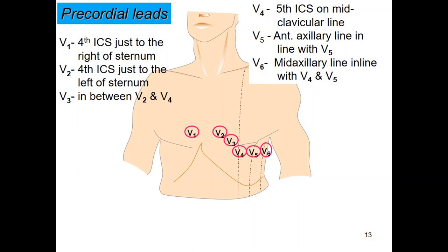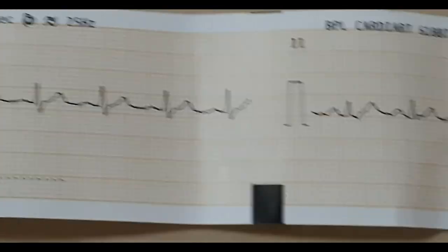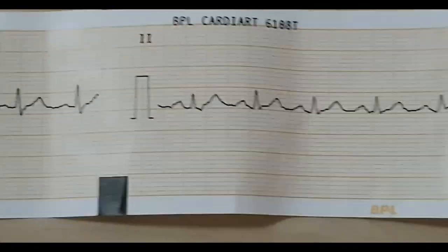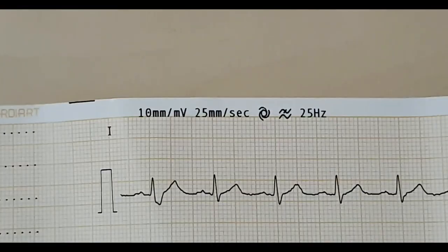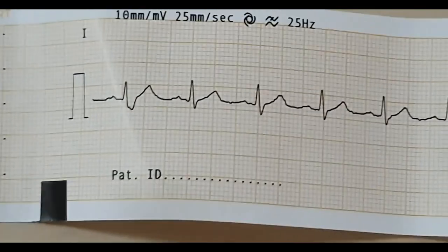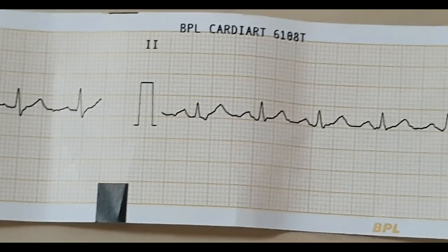So if you connect all these 12 leads properly, connect it to the ECG machine, turn on the machine automatically or manually, you get a strip of ECG. The paper runs with a specific speed. The recordings are done because it's a continuous activity, the cardiac cycle takes place. So the potentials generated every cycle are sequentially recorded one after the other. You get a strip of ECG.